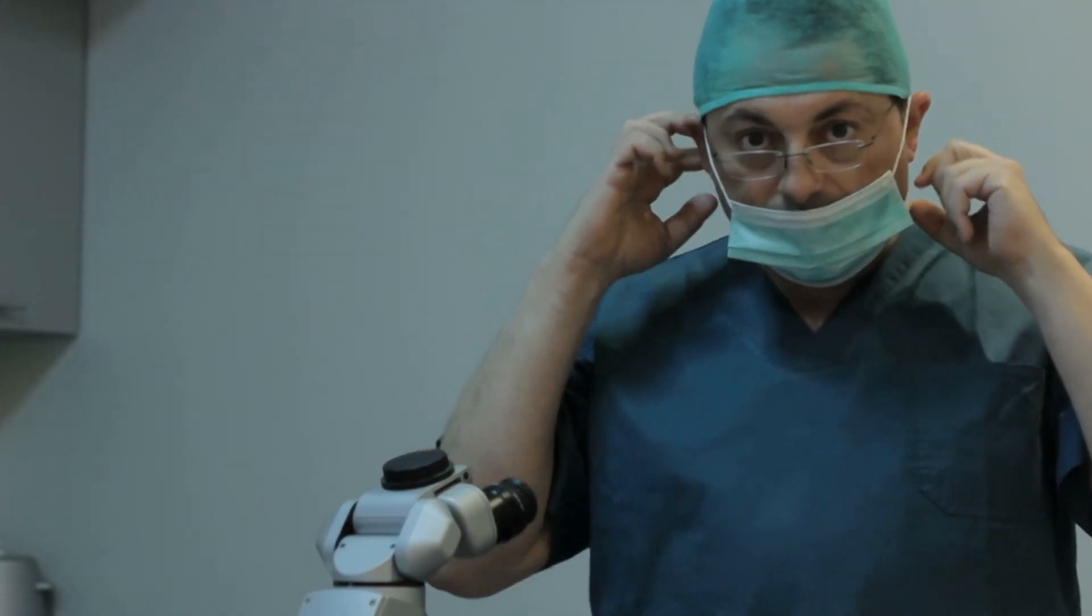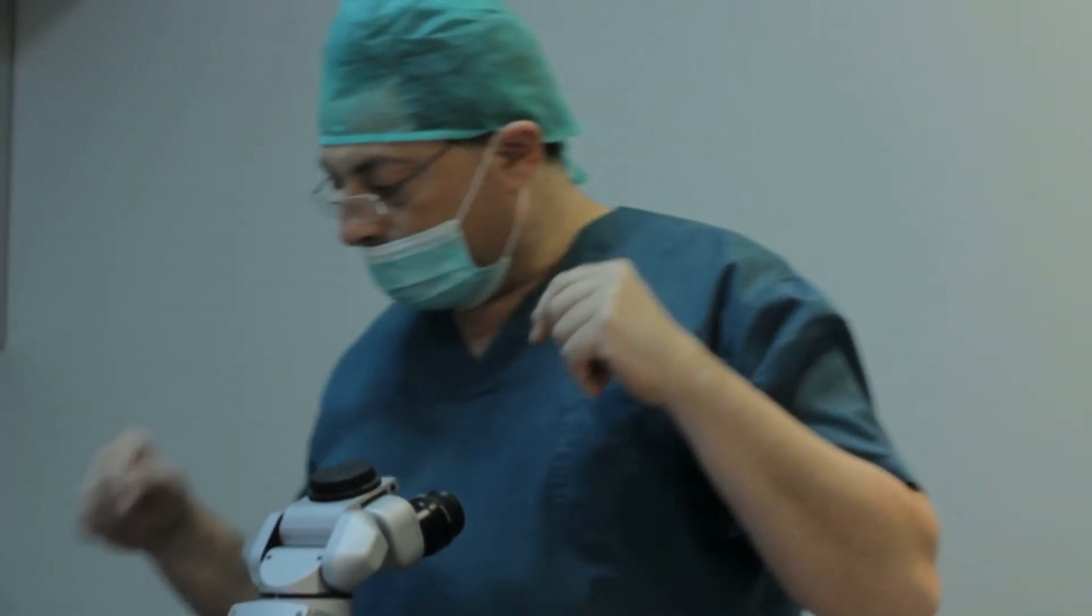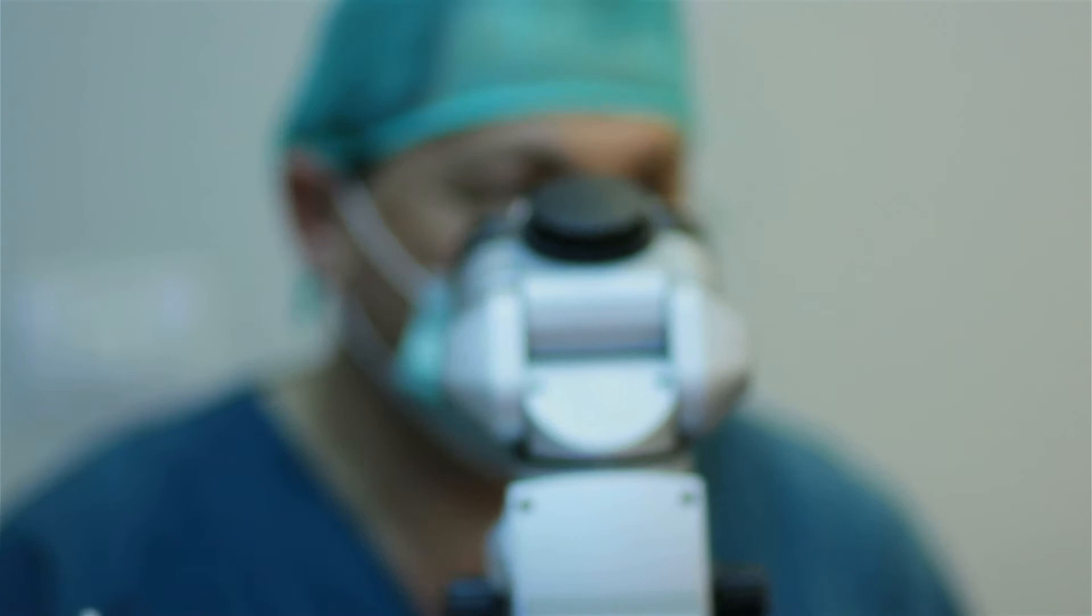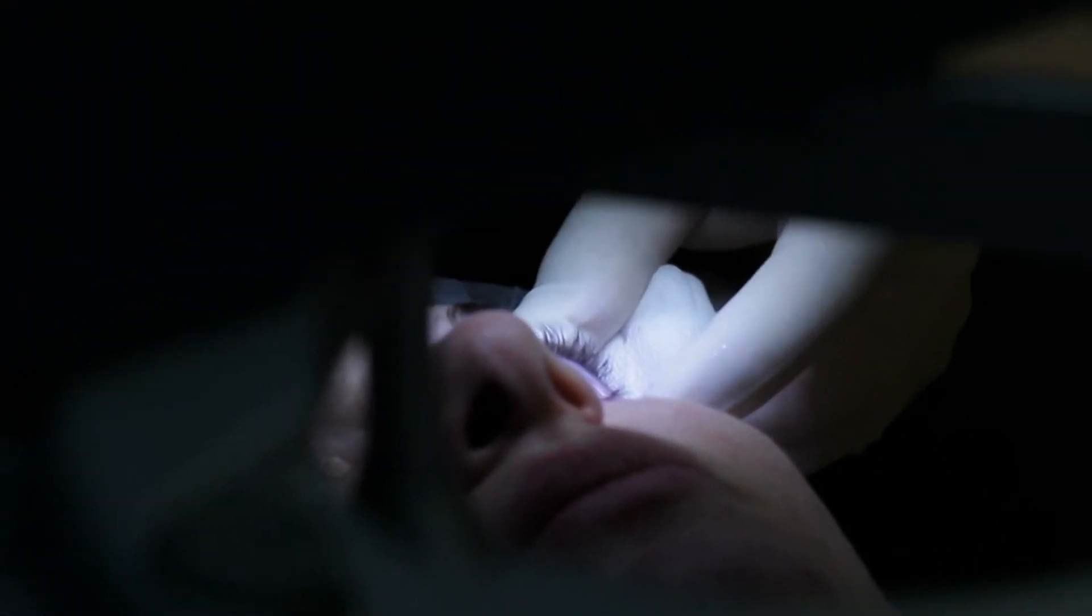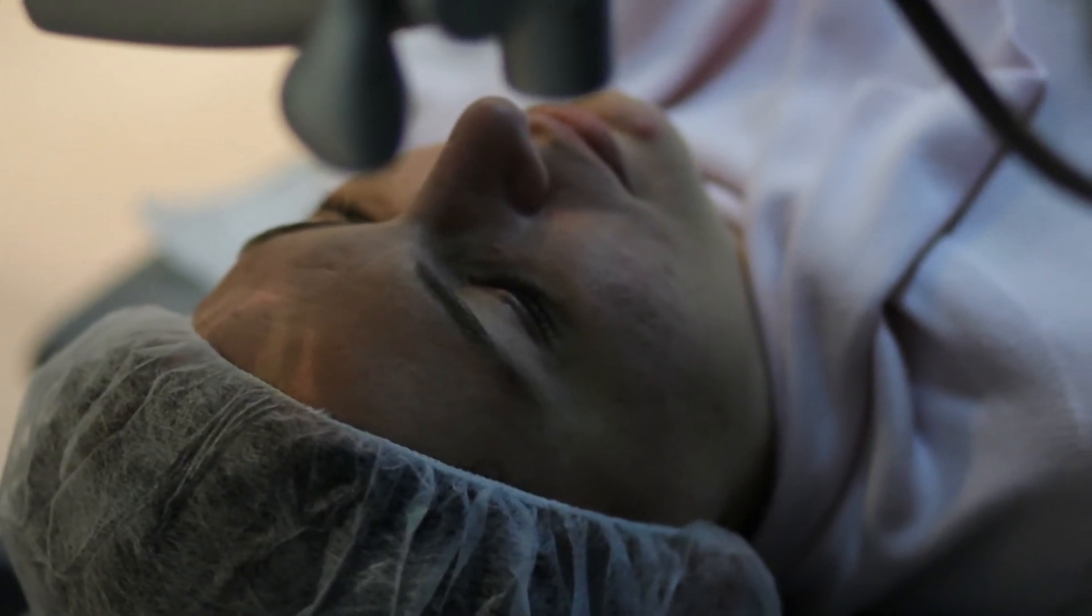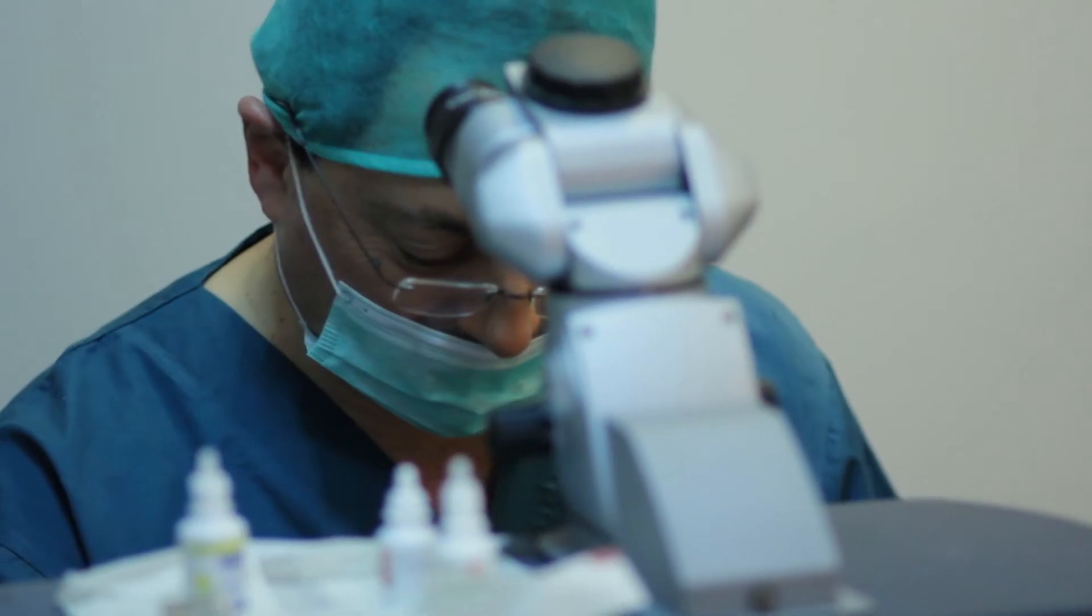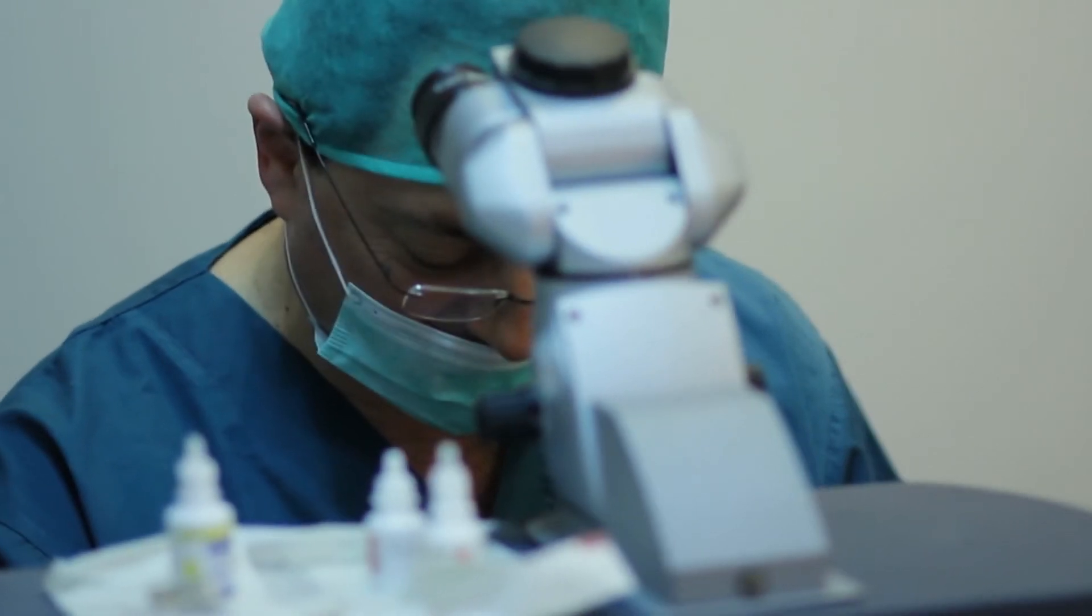Ayelet, 35 years old, was tired of wearing glasses and contact lenses. They also interfered with her work in the office. She decided to have the surgery done and to see the world through different eyes. It's a procedure that is called classic LASIK. It's the most common procedure one can have for removing glasses or reading glasses, in the case of this nice young lady.